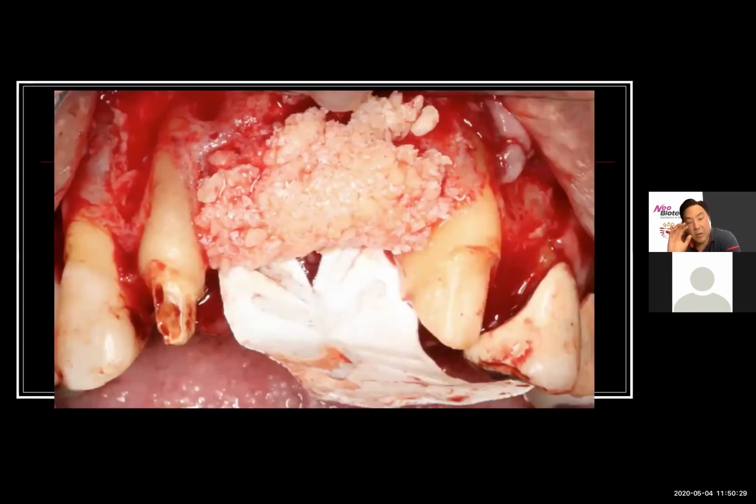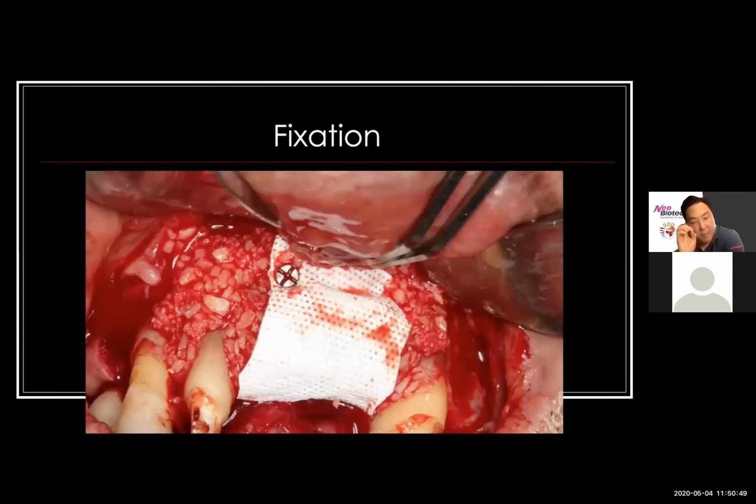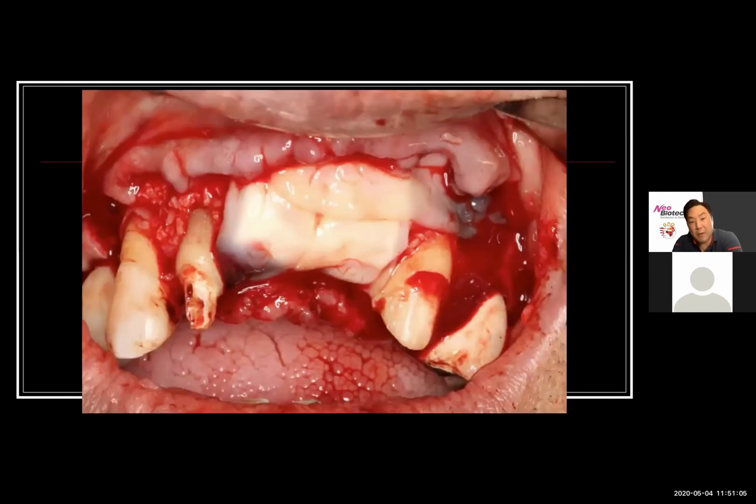And then I'm going to lay down the allograft and xenograft graft complex over that. And that also has some autogenous bone mixed within it. And then at the same time, I'm going to try and see if we can gain some attachment on the natural teeth as well. So we're going to graft just a whole area to try and regenerate as much as we can. So I'm going to over-engineer and overbuild. And then, again, critical to these types of procedures, we have to have graft immobilization. So that means you got to fixate these membranes so that there's no movement amongst the graft complex. So fixation, and then I'm using, again, PRF membrane.